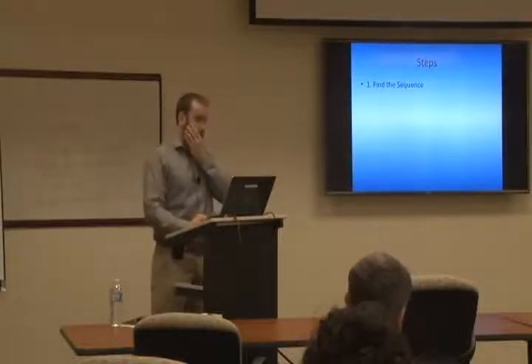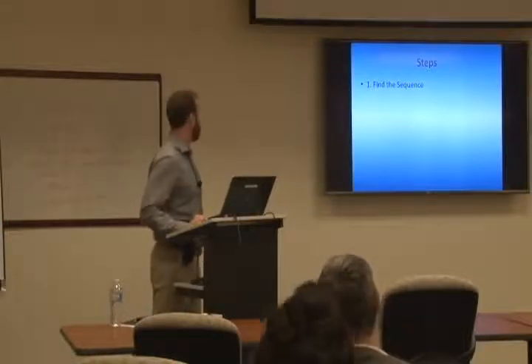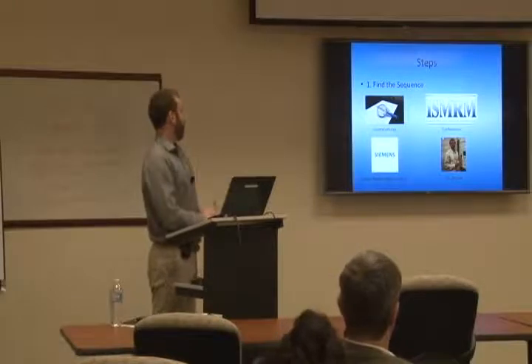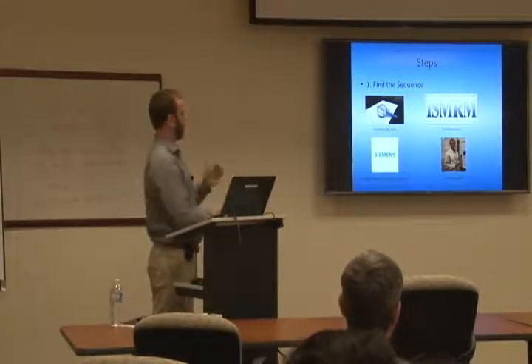So just quickly, I'm going to go through the steps that we would take to get the sequence onto the scanner. First of all, you've got to find the sequence. You read it in journal articles. You see that people are using this fancy new sequence.